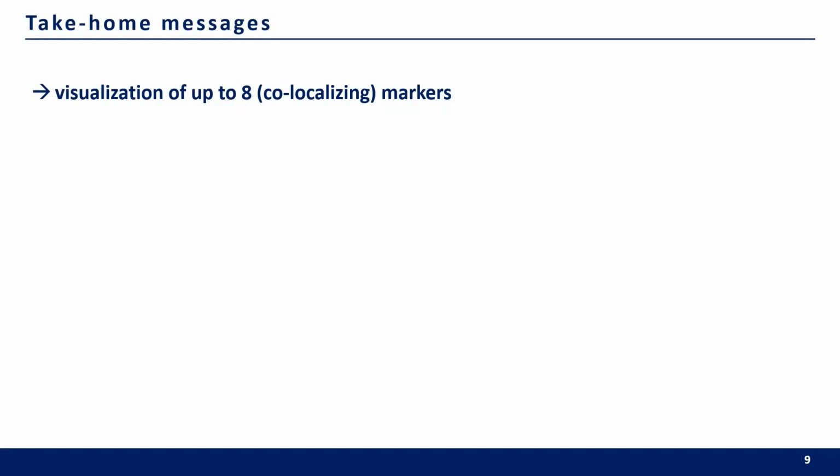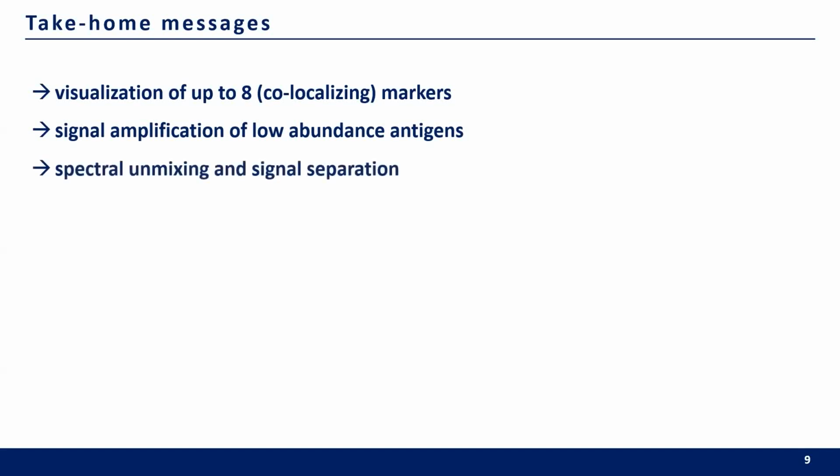Multispectral immunofluorescence allows the visualization of up to 8 different antigens, even if they have the same cellular localization, therefore maximizing data collection from limited samples such as tumor biopsies or clinical specimens. The use of tyramide-bound fluorophores in the immunofluorescence staining cycle allows for signal amplification of low-abundance antigens, thereby enhancing the fluorescence signal on the tissue equally for all epitopes.